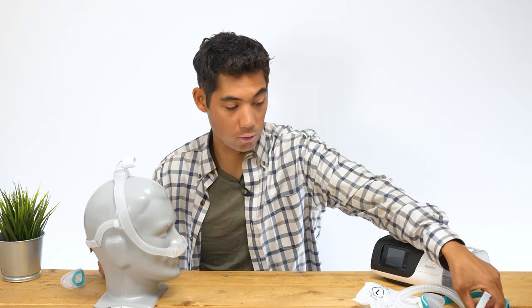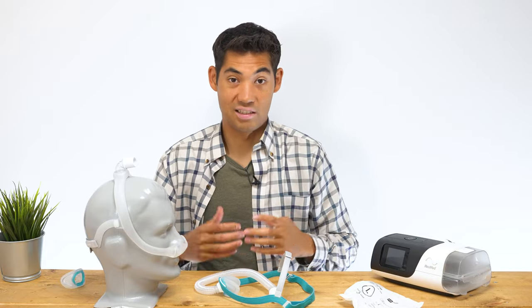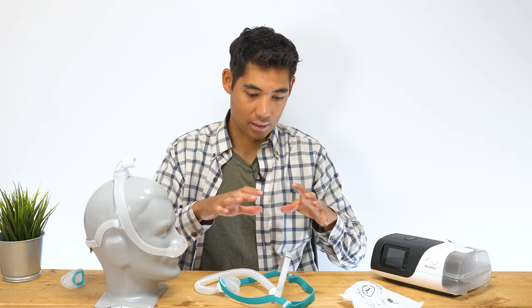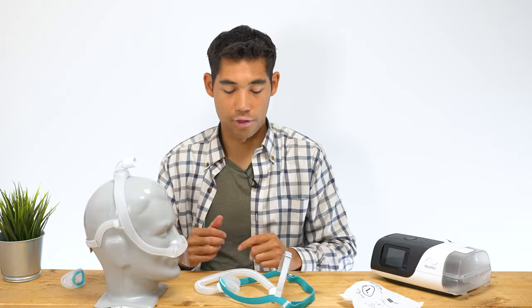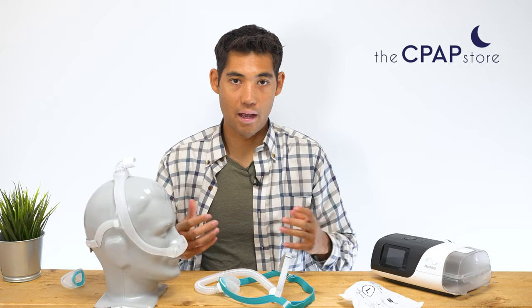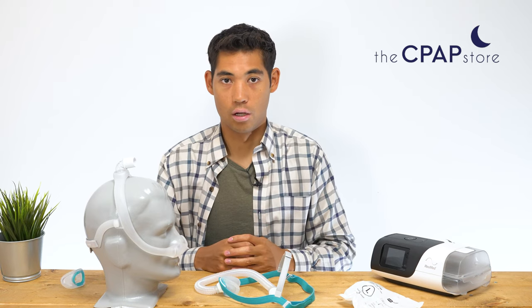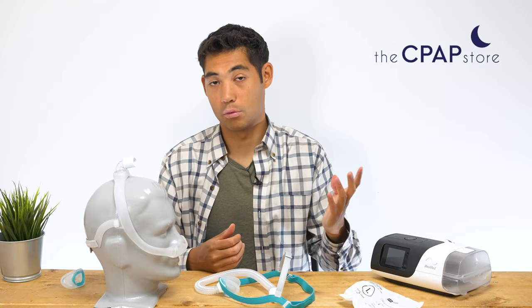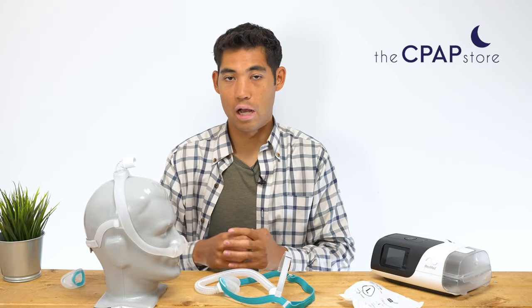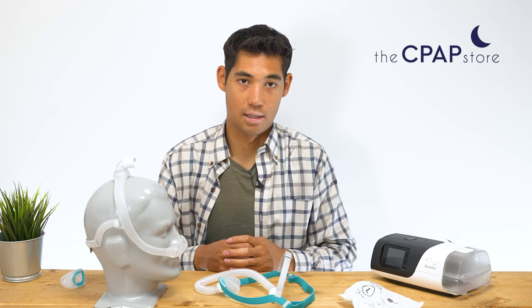I hope you enjoyed the review of the Evora nasal mask. I know I was harsh on it — I do believe it's a really great and simple mask to go on and off, but it's obviously going to work for some people and not others. If you want to see more mask reviews, check out our YouTube channel. If you choose to buy one of our masks or machines, check out cpapstore.ca — we are Canada's biggest supplier of CPAP supplies, and you can contact us directly on the website or via chat with any questions.